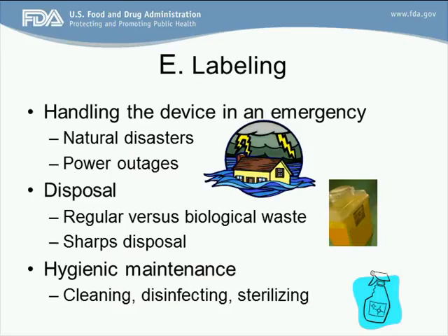And finally is the hygienic maintenance area. And again, I talked about maintenance earlier, but if this is the cleaning or the disinfecting or the sterilizing or the drying, whatever it is that they need to know to do and what types of materials they need to use in order to clean that device properly.